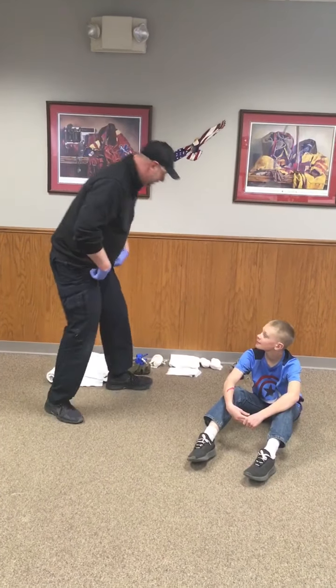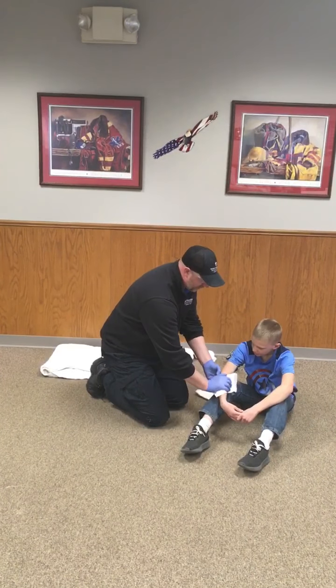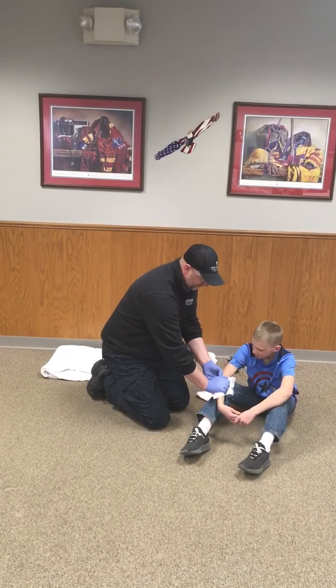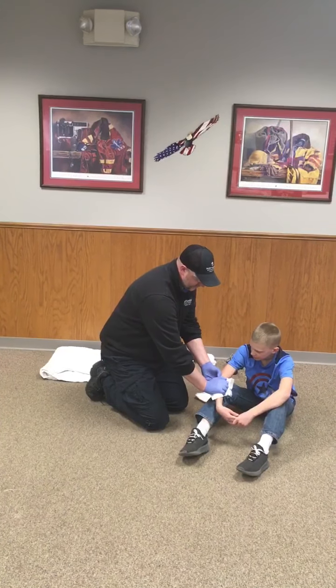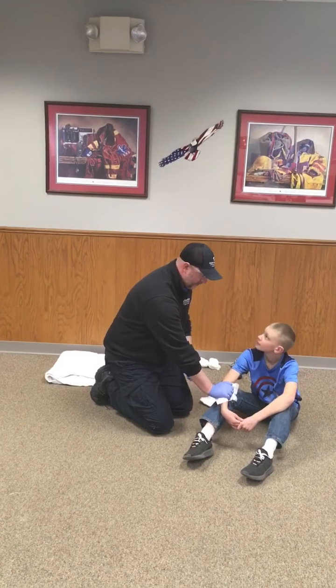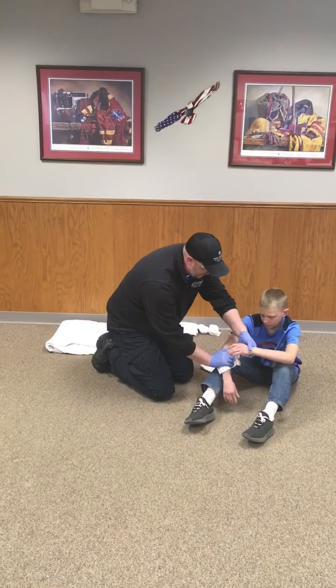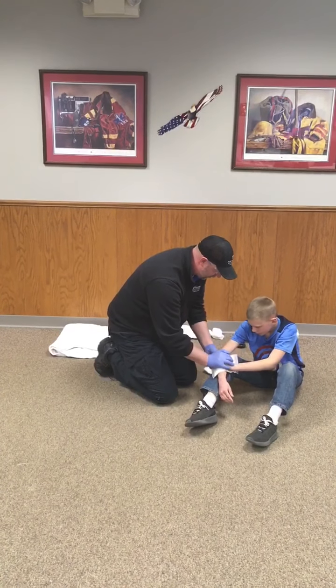I'm going to go ahead and grab a bandage and apply direct pressure to the wound. After a little bit, the evaluator will tell me that the wound continues to bleed through. When that happens, I'm going to have my patient hold direct pressure right over the wound while I go ahead and grab my tourniquet.